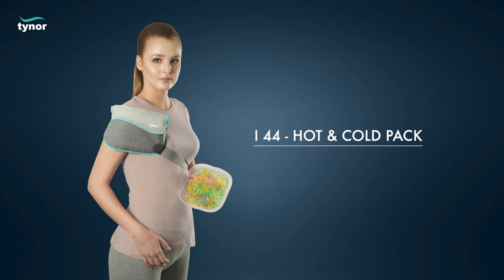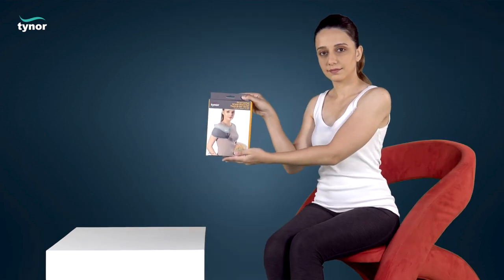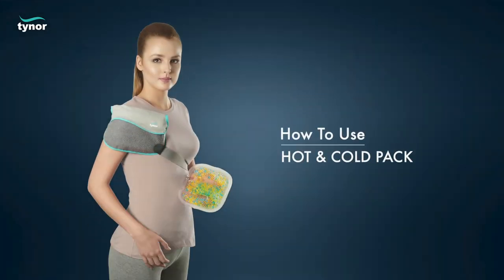Here we will discuss how to use the hot and cold pack. The hot and cold pack is available in universal size. Now let us see how to use the hot and cold pack.